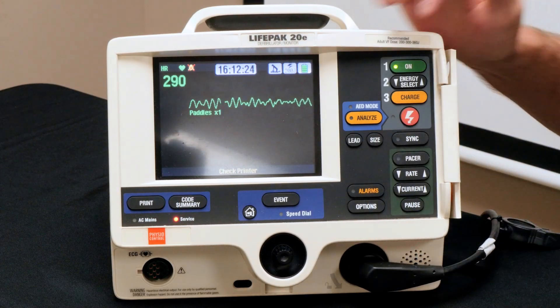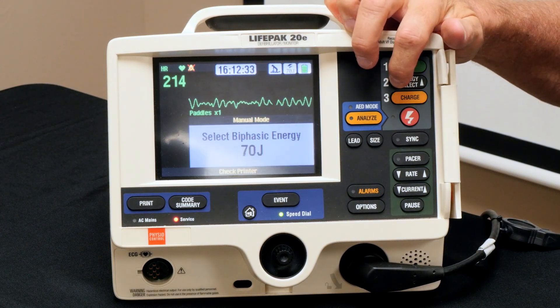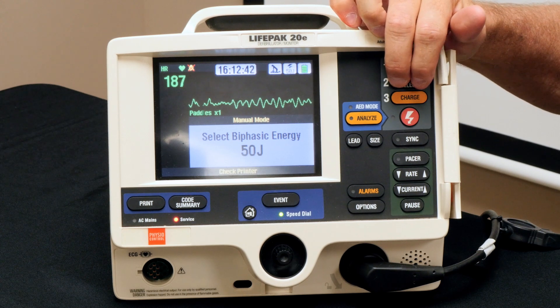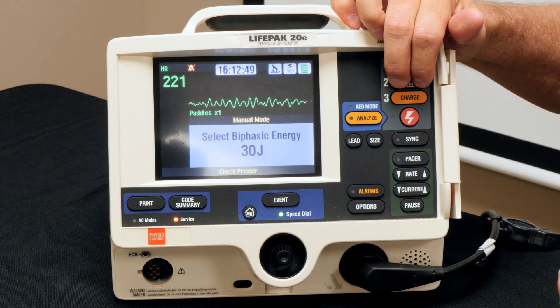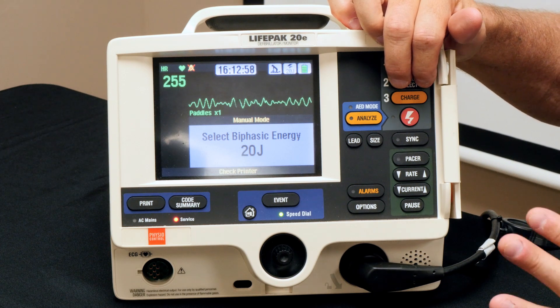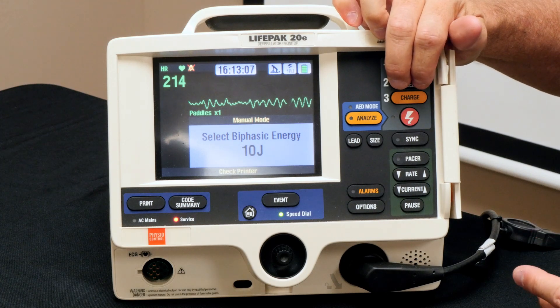When using the defibrillator, remember you can dial it up or down. If you've got a 25-kilo kid, double it — shock at 50 joules. A 15-kilo kid: 15 times 2 is 30 joules. A 10-kilo one-year-old: double it, you go to 20 joules. Now, how low can you go? Depending on the defibrillator it goes 20, 15, and when it hits 10 you're into really small, newborn-type doses.